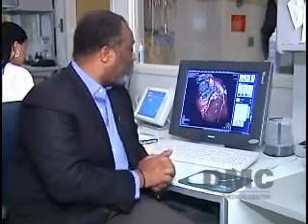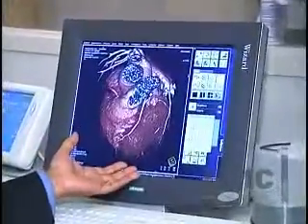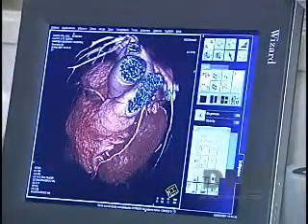The patient simply lies on a table while an IV delivers dye to the area for contrast. Within a few minutes, the patient gets up and is dressed, and the doctor is looking at an image of the heart as though he could hold it in his hands. We can just look at it in front of us. It's just like the surgeon being there and looking. My joke about it is that it'll take you longer to sign the consent, have the IV started, than to have the test. It's that simple.